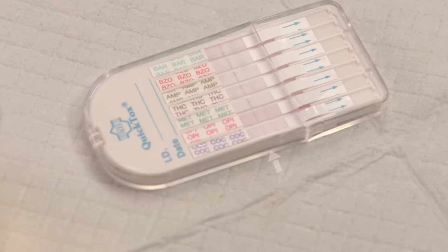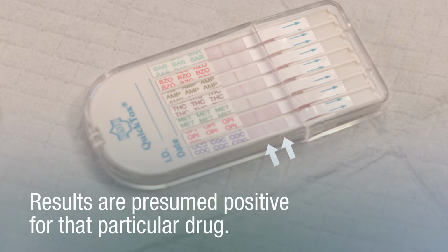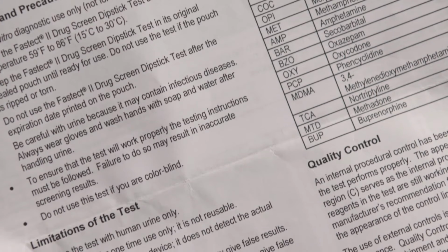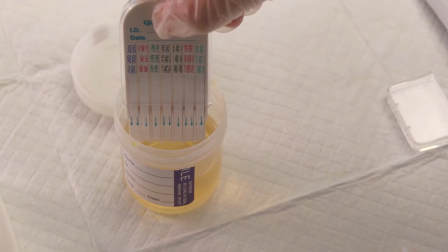When the control band is visible in the control region, C, and no visible band in the test region, T, the result is presumed positive for that particular drug. When no band appears in the control region, the test is invalid regardless of the test results. There must be a control band in the control region. If the test is invalid, check testing procedures and samples. Repeat the test using a new device.